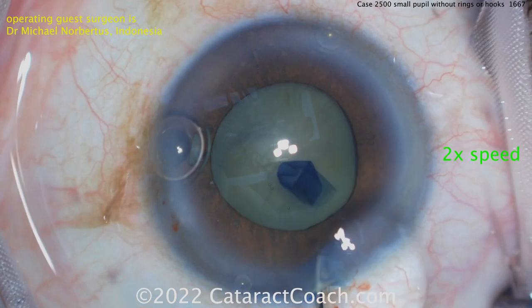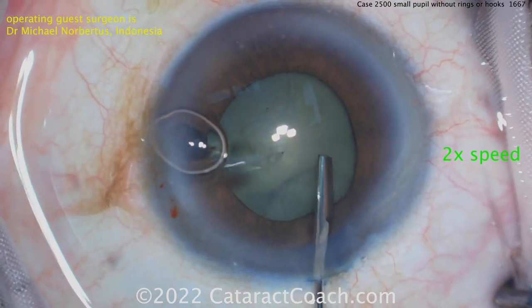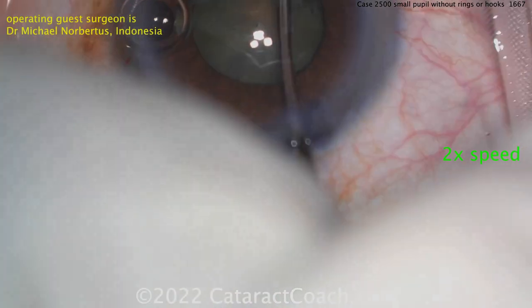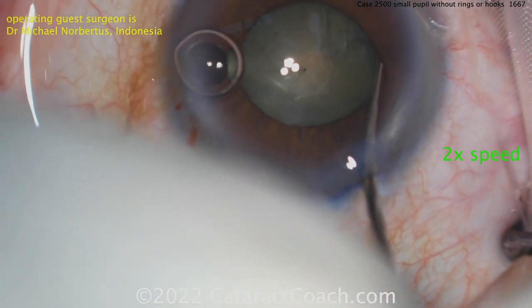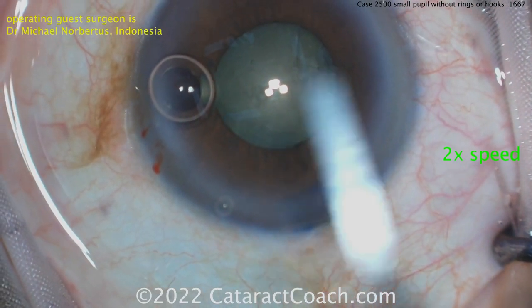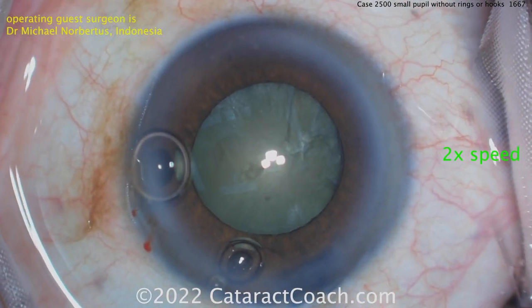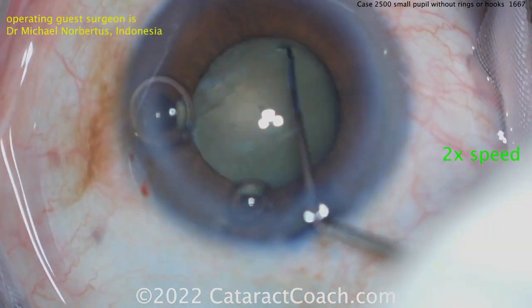There's the paracentesis - let's see some hydrodissection. Now the pupil - look at it, it wants to come down. Maybe it's a Flomax case or something of that nature. That's okay, we're going to roll with it. Getting a good hydrodissection there, trying more visco out to coat the endothelium.